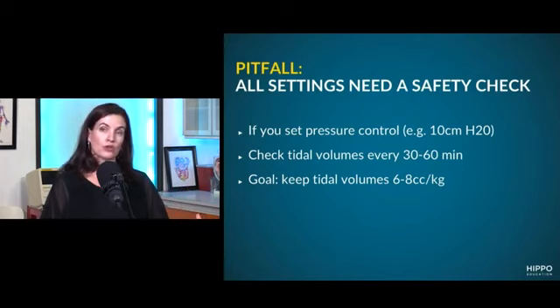So you want to make sure you're documenting an ideal or predicted body weight for all of these patients who are ventilating. I love how, with regard to the safety check, depending on which mode you're using, if it's pressure control or volume control, you're using the opposite as your safety check. For me, I've always used predominantly the volume. And so for me, it's the pressure. And so the plateau pressure, the number I always remember is 30.